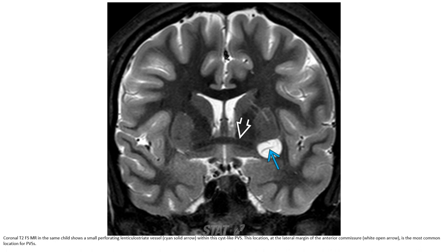T2 image in the same patient shows a small penetrating lenticulostriate vessel lesion. T2 image shows the PVS at the lateral margin of the anterior commissure, which is the most common location for PVS in this region.